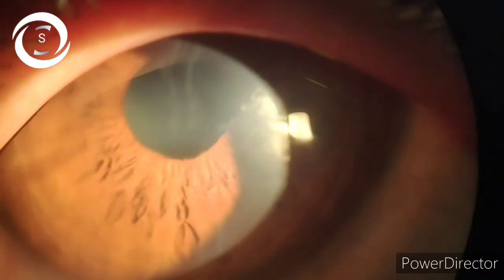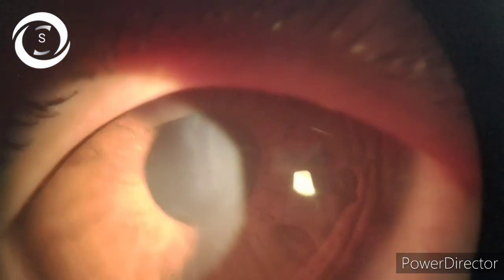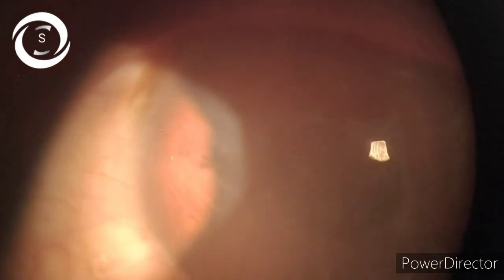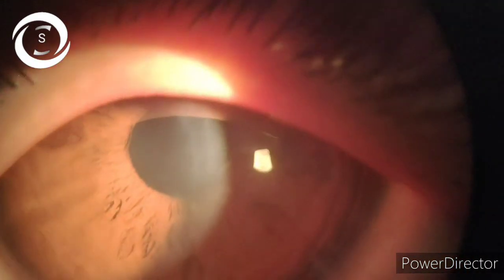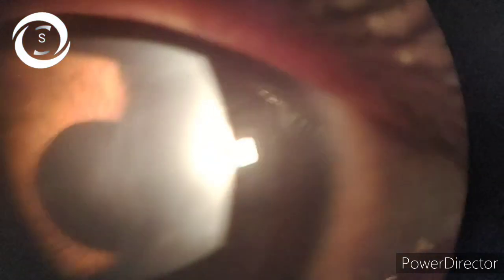Let's discuss another challenging corneal case. Here you can see there are vertical curvilinear as well as horizontal lines like a rail track or tram track with irregular edges. This patient had a large cornea and had undergone anterior filtration glaucoma surgery for congenital glaucoma in this eye. This eye was saved, whereas the other eye had a hazy cornea and enlarged buphthalmos. These lines are called Haab's striae.